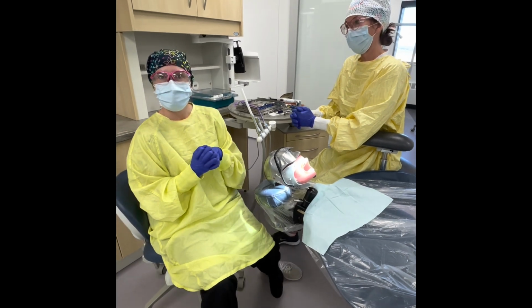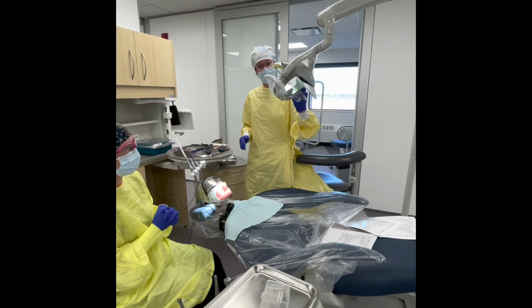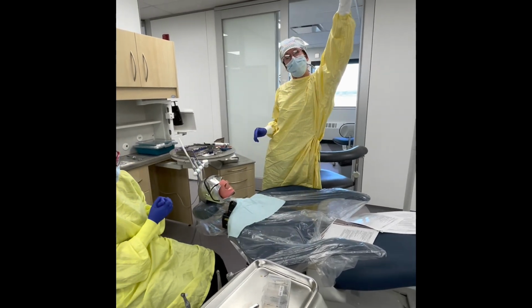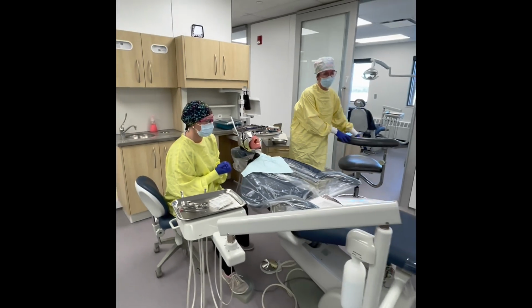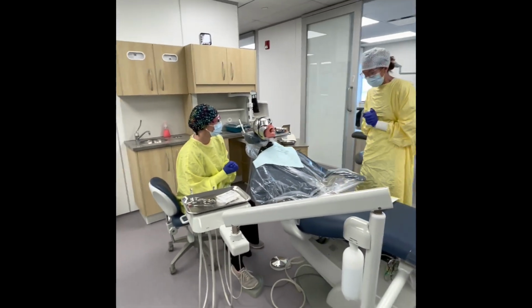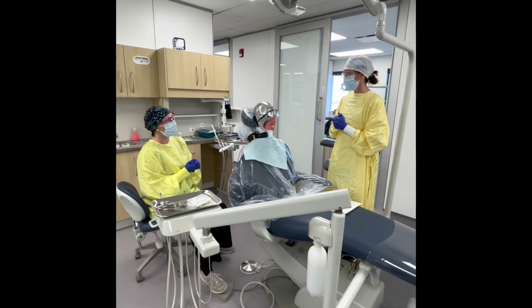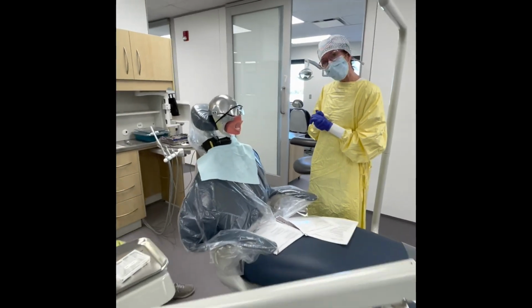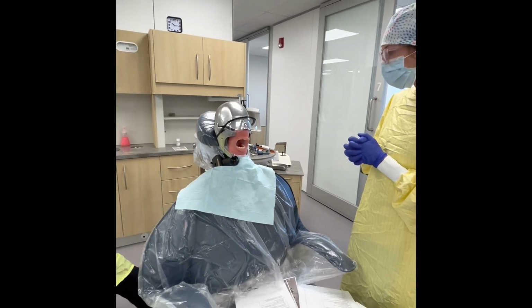So what we're going to do next is seat up our client. Your operator will likely be the one adjusting the chair. The assistant will have to get up and ensure that the light is out of the way of the client so they don't get their head hit on it when they come up, okay? So the first thing we're going to ensure that we do is our wellness check, okay? Martha, how are you feeling? You've been laying back for quite some time now. Is everything okay? Yes? Okay.